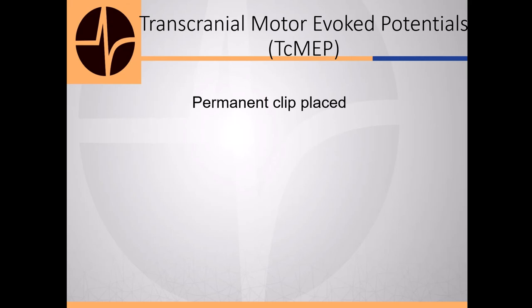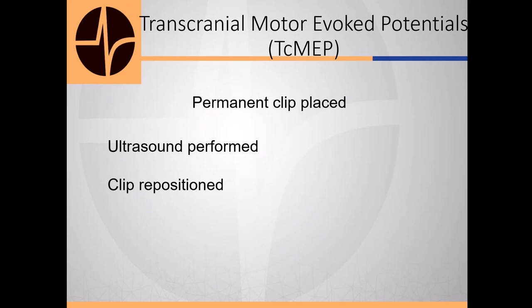If the changes occur when the permanent clip is placed, then they're going to bring an ultrasound, make sure that there's blood flowing through there. Might need to reposition the clip.